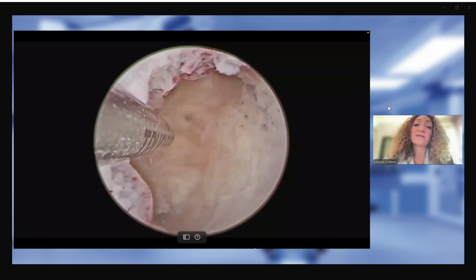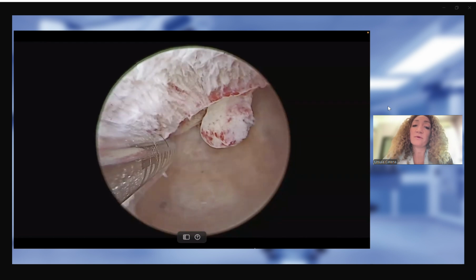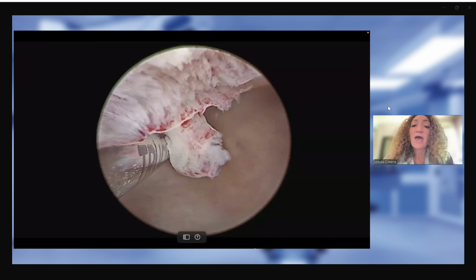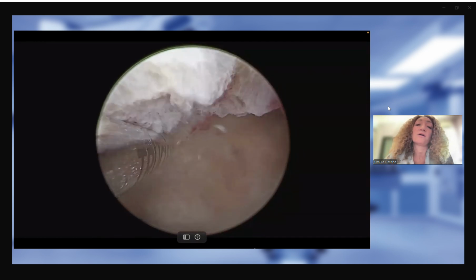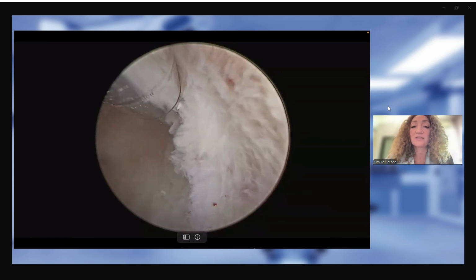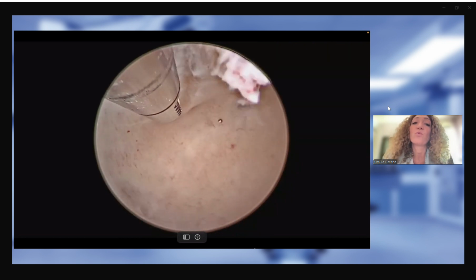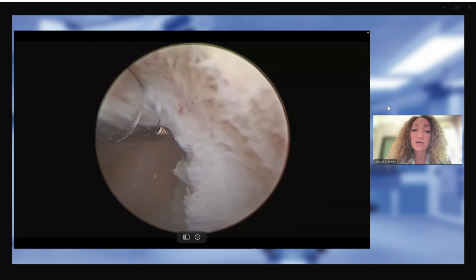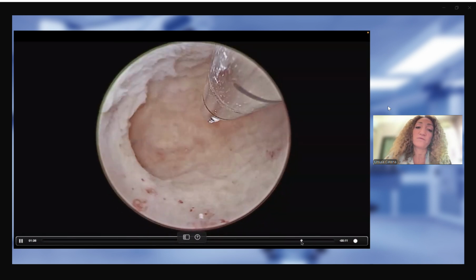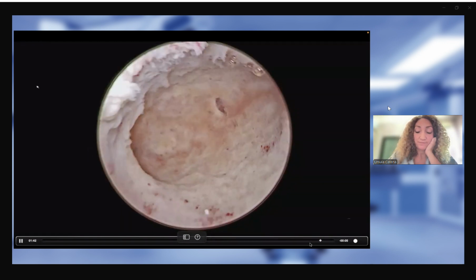With this instrument, which is a totally mechanical instrument, we have no risk of intrauterine adhesions, and after stopping progestin therapy, the endometrium starts to regrow, and it is a totally normal endometrium because we have never treated that uterus with electrosurgery. And I want to show you the final view of the uterus after the complete visual D&C.